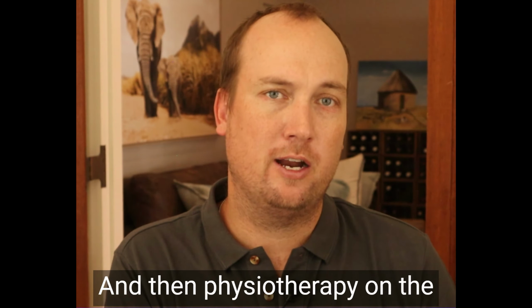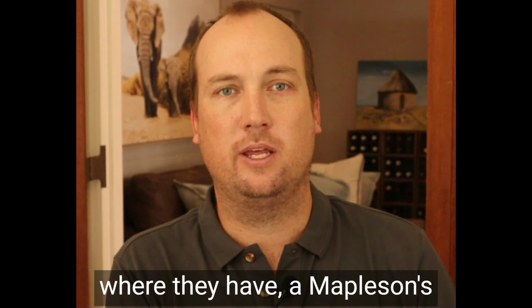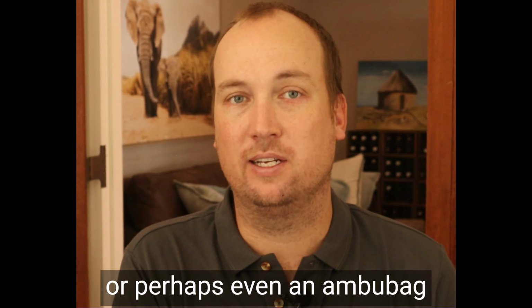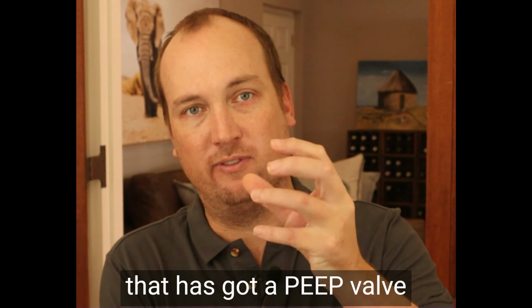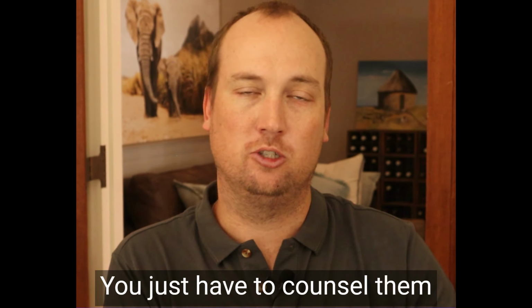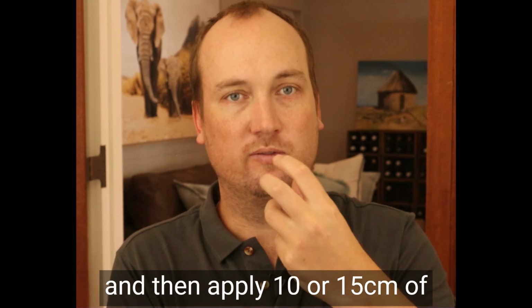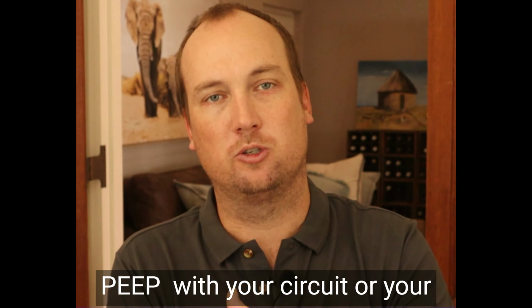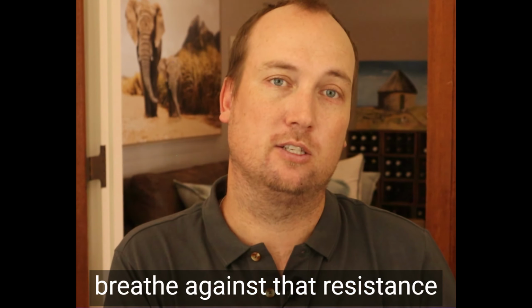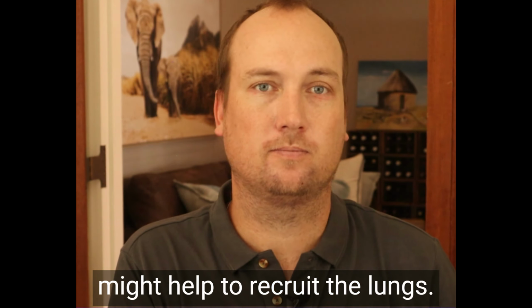And then physiotherapy on the chest can also recruit the lungs. If you're working in a unit where they have a Mapleson circuit in the recovery room, or perhaps even an ambu bag that has got a PEEP valve attached to it, one can apply external PEEP to the patient. You just have to counsel them and tell them what you're doing, and then apply 10 or 15 centimeters of PEEP with your circuit or your ambu bag and get the patient to breathe against that resistance for a few minutes, and that might help to recruit the lungs.